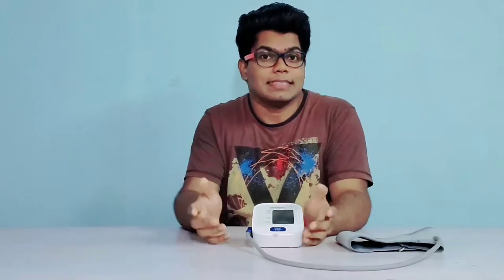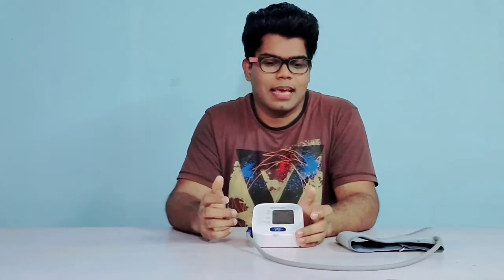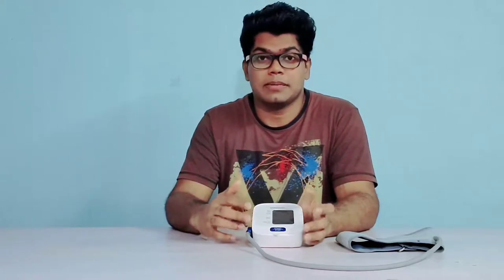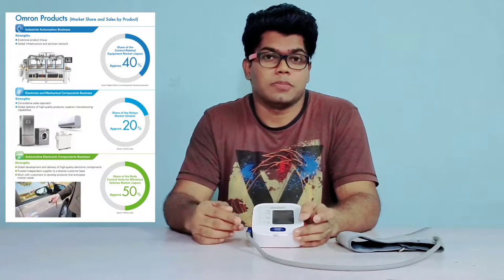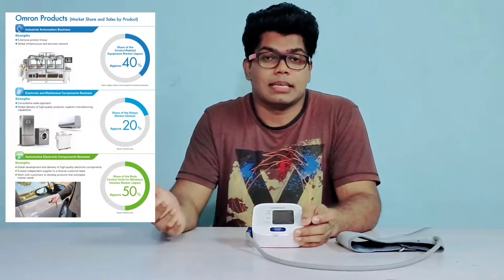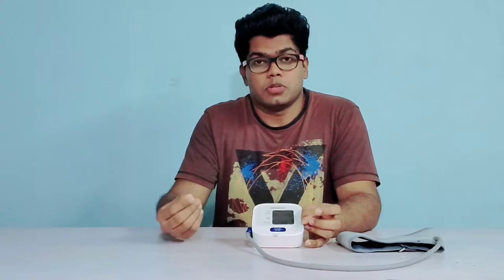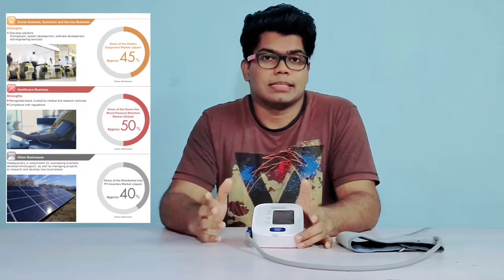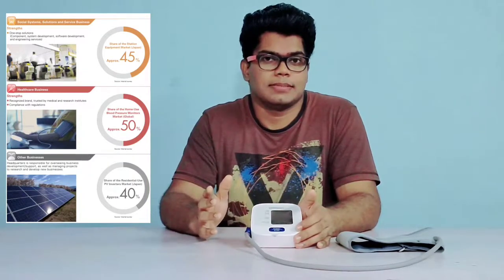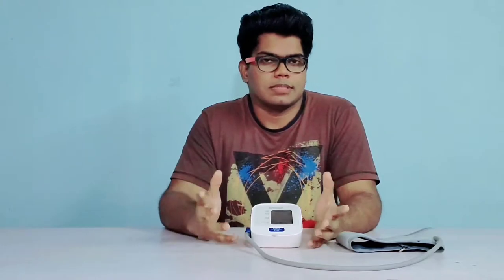Alright guys, here is my review after using this product for 90 days. First, let's discuss why Omron — why most doctors suggest this brand over any other. I think it's due to several reasons, first being the brand value. Omron is a Japanese brand and they are experts in industrial automation, manufacturing of electrical and mechanical components, EV parts, and automotive electronics. Moreover, Omron holds over 50% of global market share in the home blood pressure monitor business. That's how huge Omron is, and maybe that's the reason doctors often suggest it.